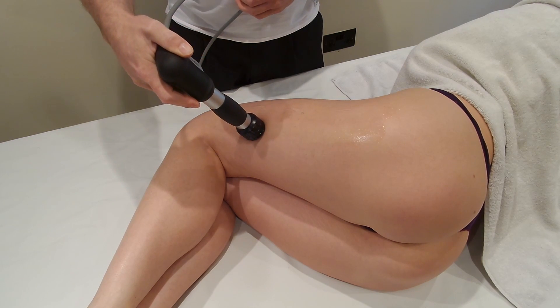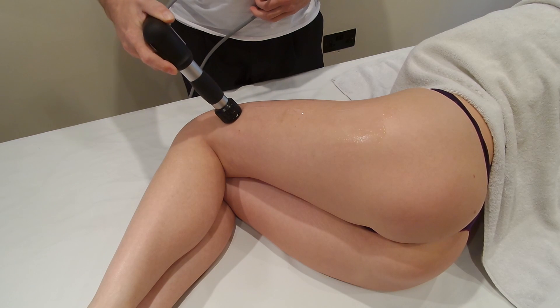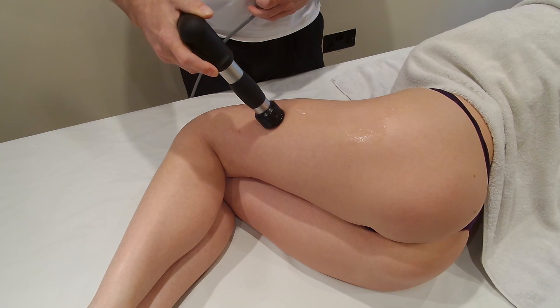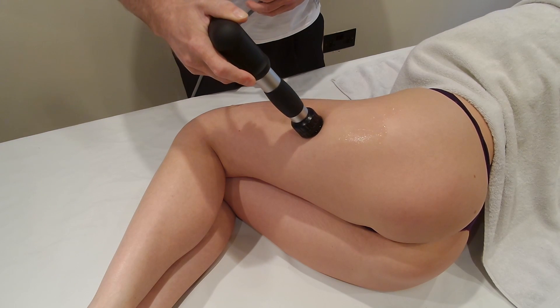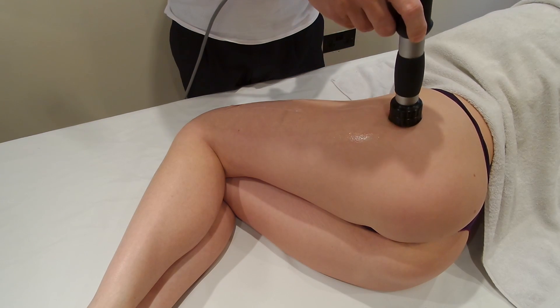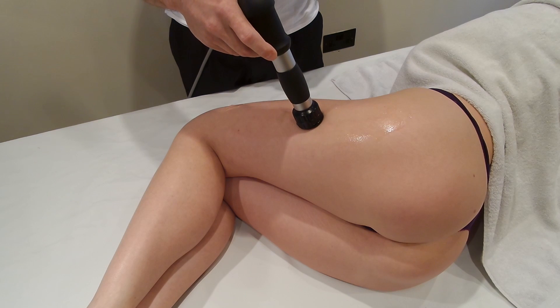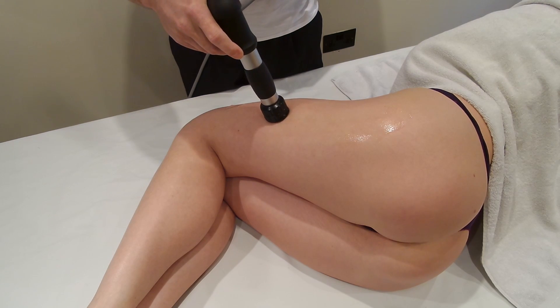We start applying the treatment, coming down in a fairly uniform snaking effect down the leg and back up again. This is just to make sure you don't miss any areas, but also to try and ensure that the treatment is homogeneous or equal throughout the whole of the iliotibial band.